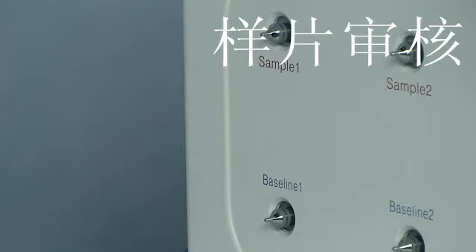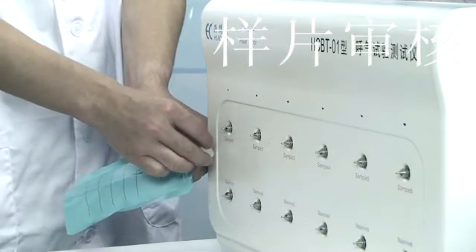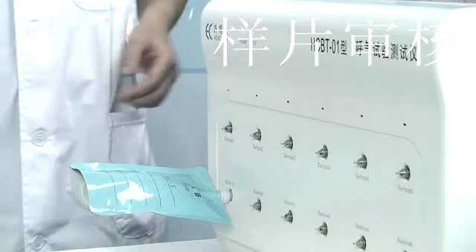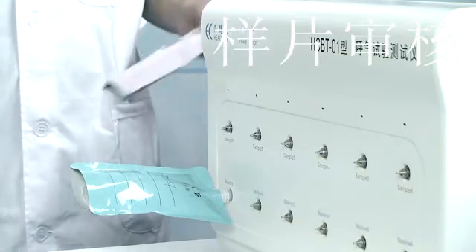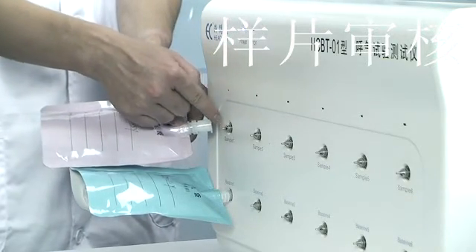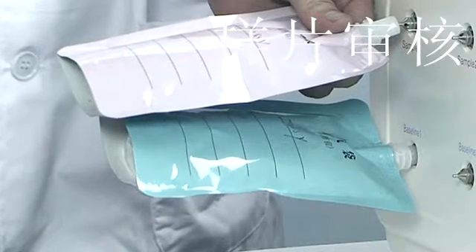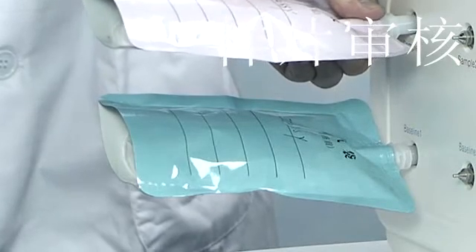The corresponding upper and lower interfaces are for a set of samples. The lower row is the baseline interface, marked with the same color as the baseline bag. The upper row is the sample interface, marked with the sample color. The baseline bag should be connected to the instrument's baseline interface. A patient's baseline bag and sample gas bag must be connected to the same set of interfaces — intersectional connection is not allowed. Keep the collecting bags at 45 degrees or in a horizontal direction, inserting to the end.